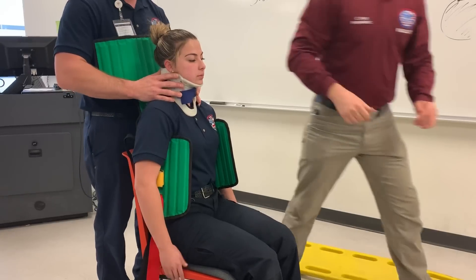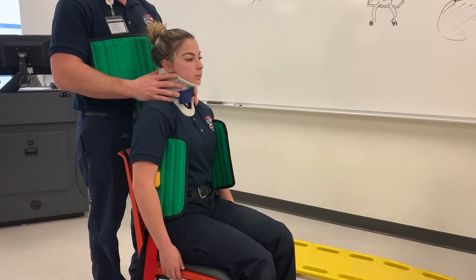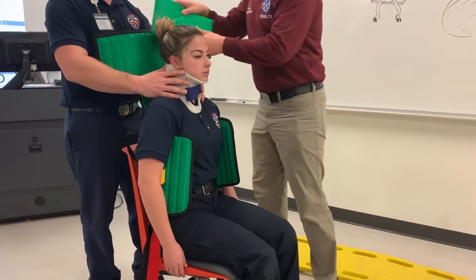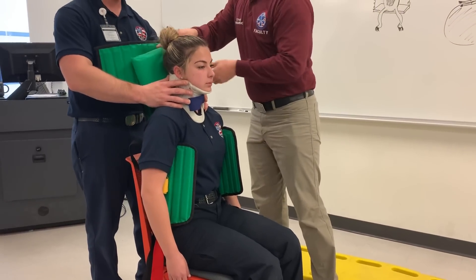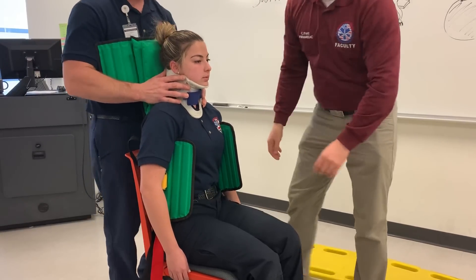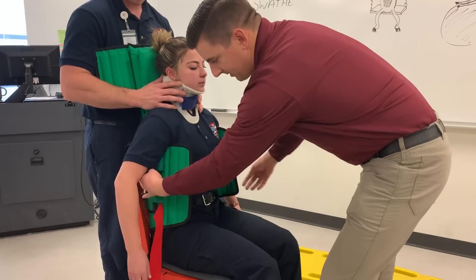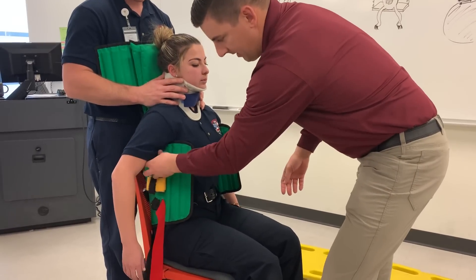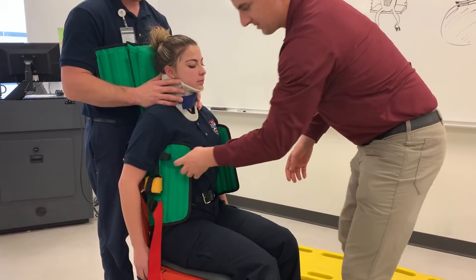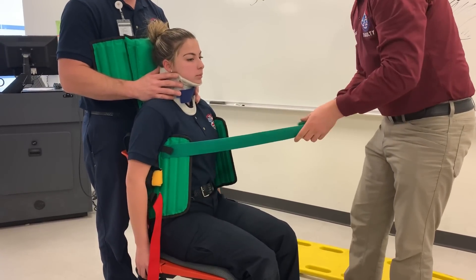We fill any voids. Now I'm going to connect my straps, leaving the top strap undone.